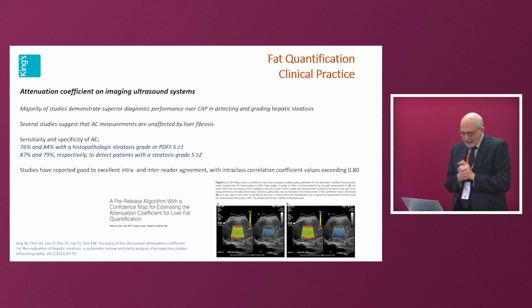The sensitivity is lower than the attenuation coefficients that are measured on proper imaging ultrasound machines, where you're looking at the liver and you know what you're looking at. And sensitivities for attenuation coefficient compared to steatosis and PDFF are 76 to 84%, 87 to 79%. So getting quite high, but still not fantastically comparable, but coming.